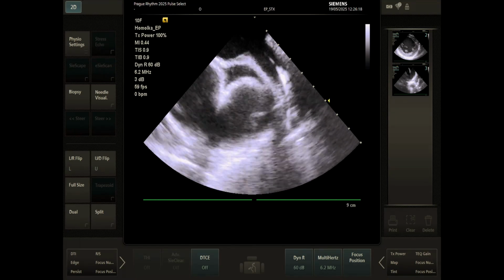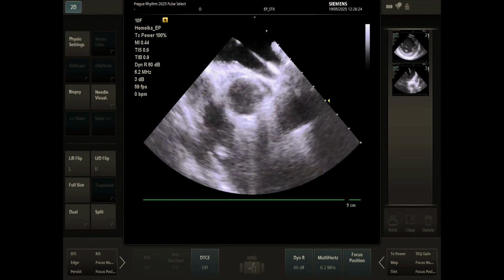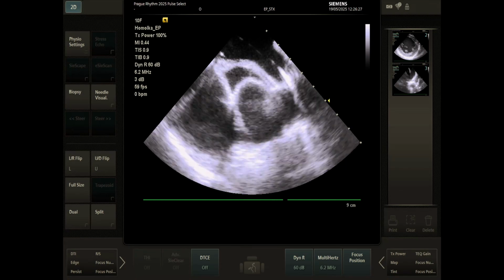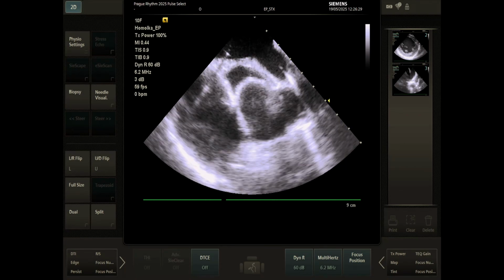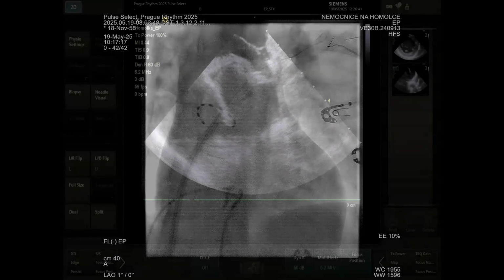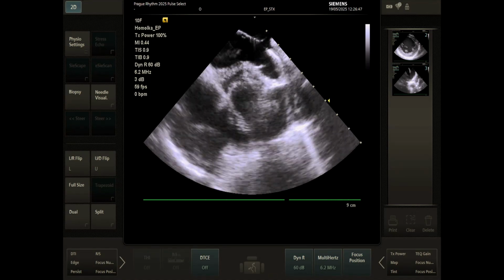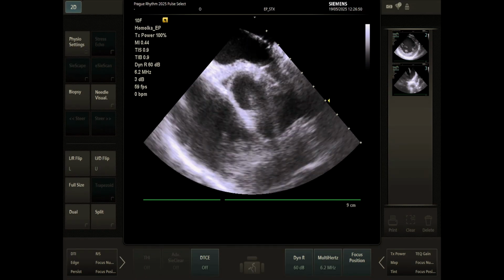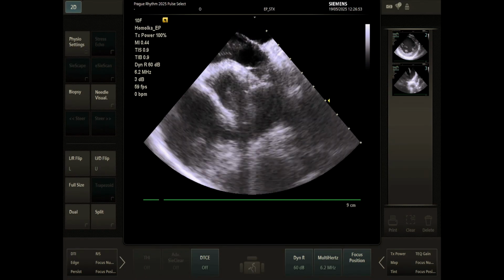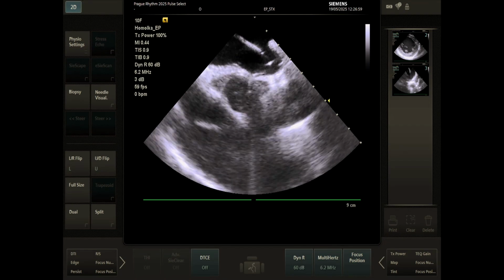So you can see that in the left superior vein, we have a wire, and over the wire, because the catheter, I need to admit it's not like the PVAC catheter, but it was the original PVAC catheter. It's an over-the-wire catheter. And so we have it now in the shape of a horseshoe, okay? So we need to move, and actually Toshi is moving the catheter towards the upper left vein in the full ring. It's very important to manipulate the full ring catheter.